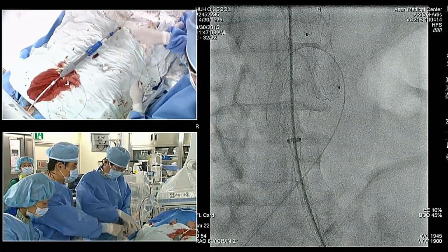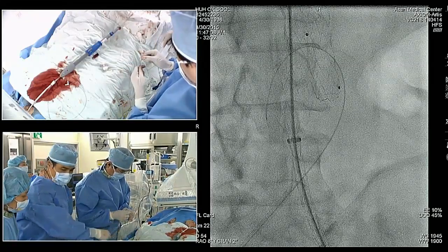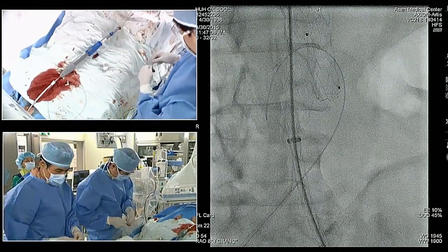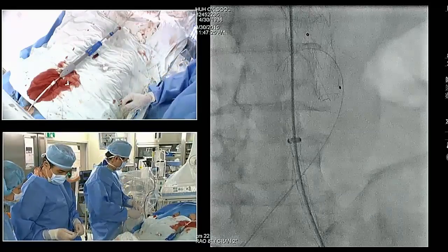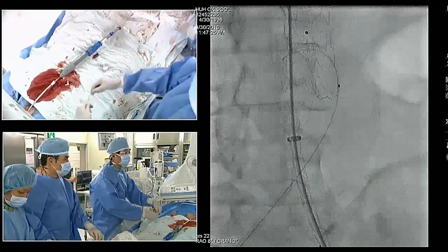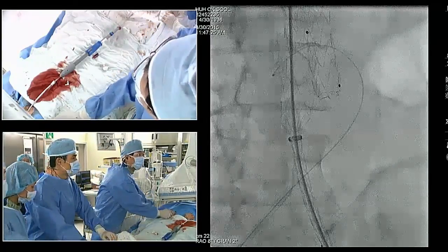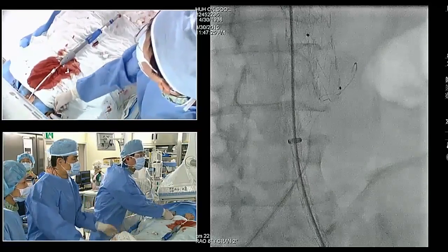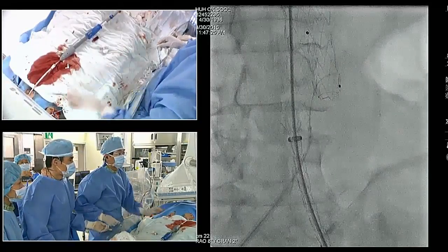And as you're doing this, especially if you have a cross-limb configuration, you have to be careful about your torque and rotation of the diagnostic catheter, because then you can wrap it around the contralateral limb more than once, in which case deployment of the endo leg is difficult. So you want to make sure you don't have wire wrapping around the contralateral delivery system. So far he doesn't. It looks okay. There you go. It's a better angled catheter.